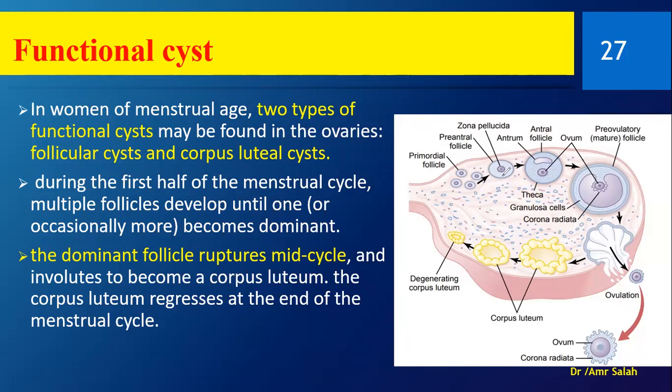First, we have this follicle, okay? And you might wonder, do we see the ovum or the follicle? Yeah, we see all of these steps, as we will see. Now, what will happen here? The follicle, every month, one of them increases in size, all right? And it increases and increases until it ruptures the follicle and releases the ovum. This is at the time of ovulation. Okay, then the rest of the follicle would form the corpus luteum, and then the corpus luteum will decrease, decrease, decrease until it forms the corpus albicans.